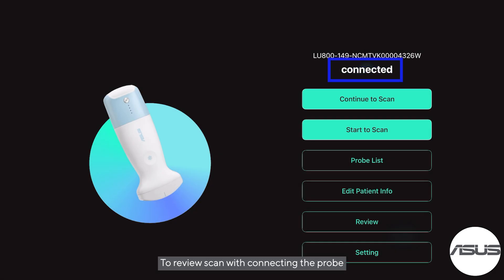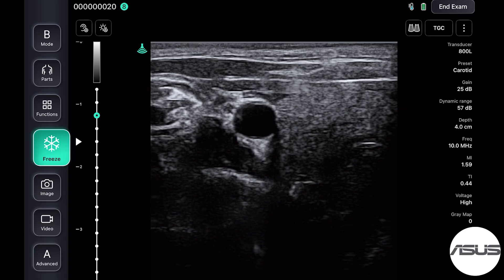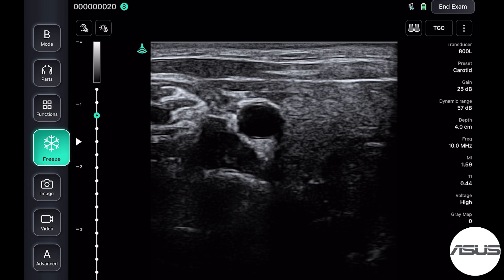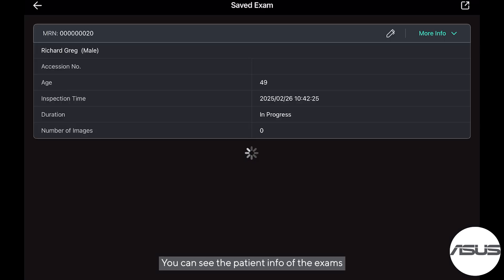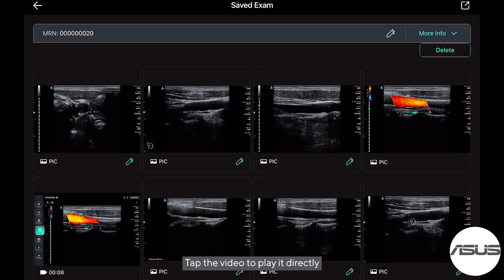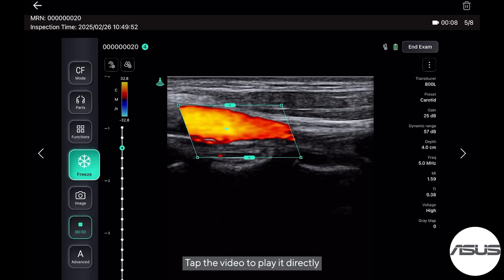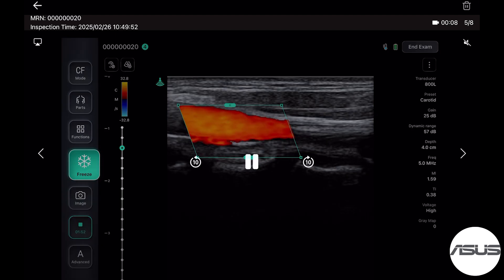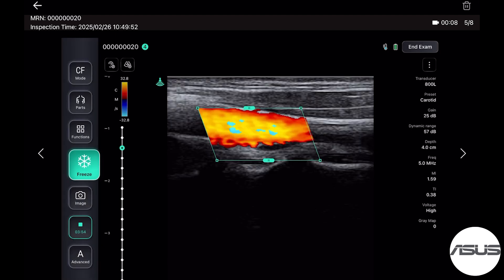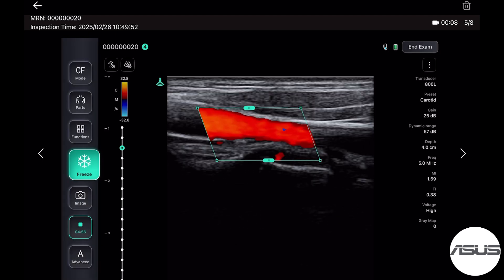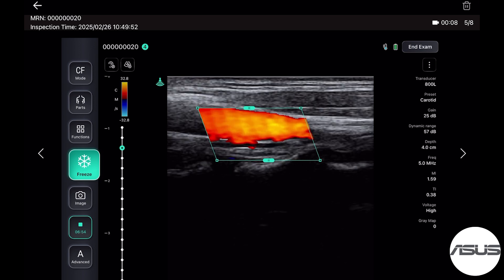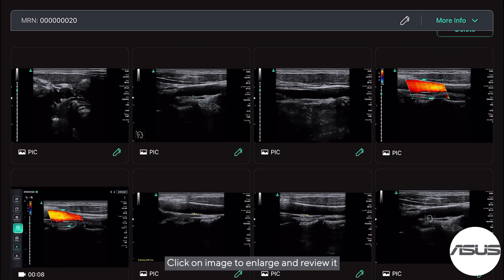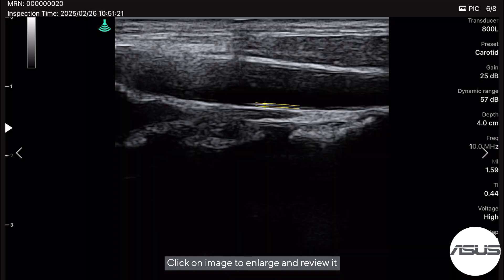To review a scan with the probe connected, tap the Medical Record Number (MRN) to review patient data. You can see the patient info of the exams. Tap the video to play it directly. Click on an image to enlarge and review it.